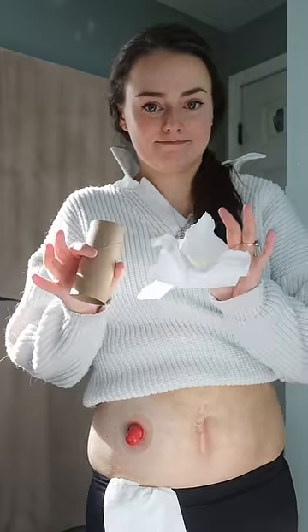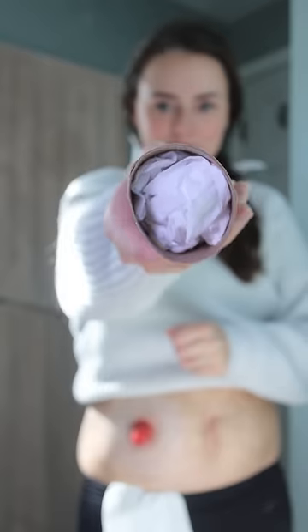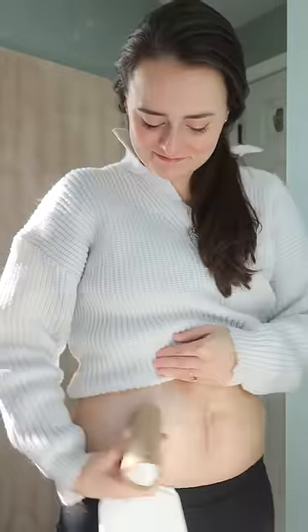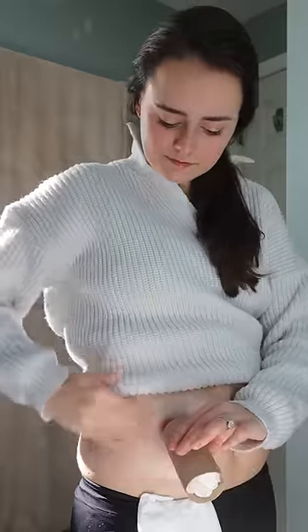Another way is to take a toilet paper roll and stuff some toilet paper into the end — enough so that you cannot see any light through that paper. Place this over your stoma. The roll will catch anything that may come out and the toilet paper will absorb it so it doesn't come out the other end. There is a product called the Stoma Genie that has a similar concept to this if you want to try.